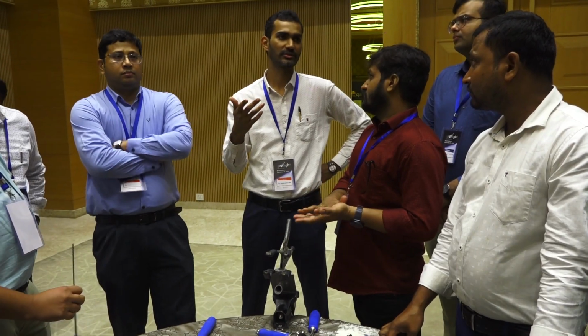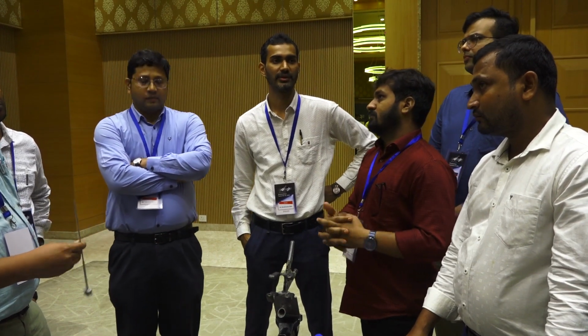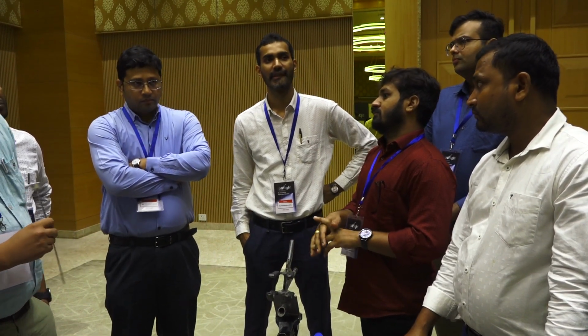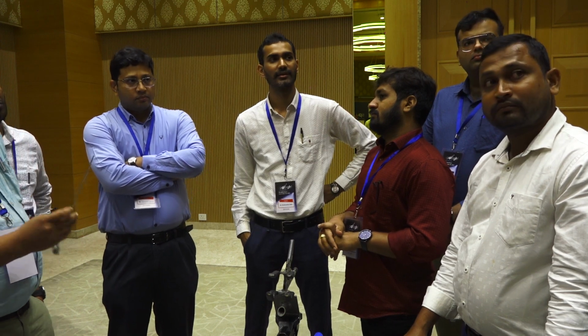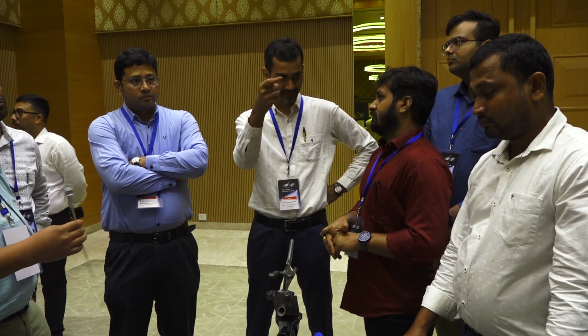Usually we don't reduce the lesser trochanter. But is there any scenario where you want to reduce it? People put screws there or put encircling wires and try to reduce that.